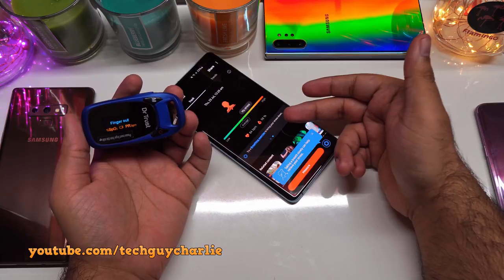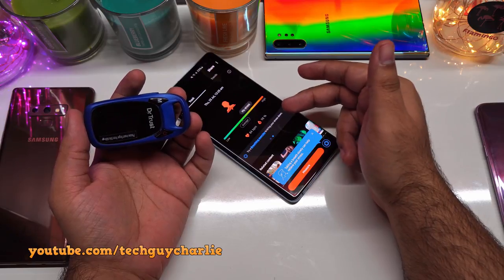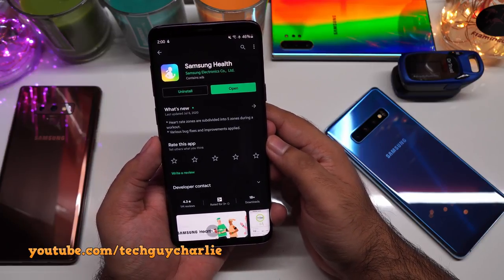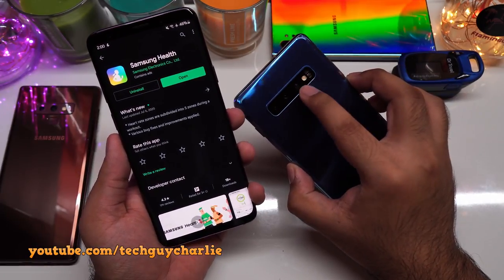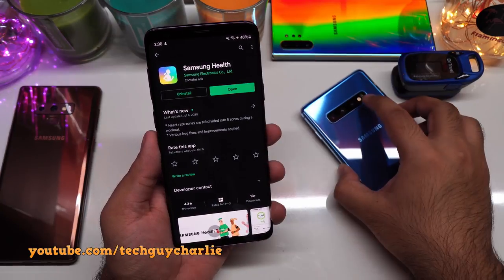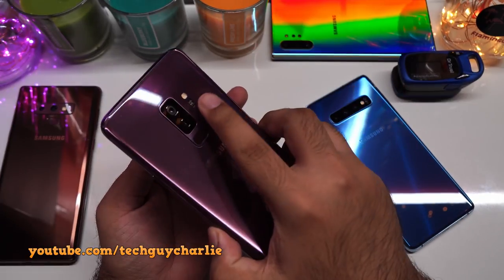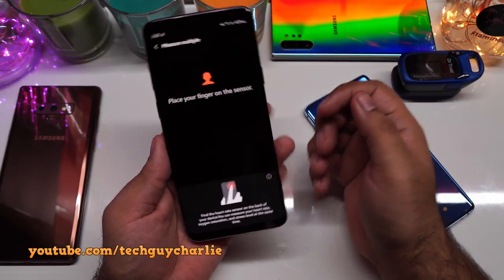The pulse oximeter on the Galaxy phone is quite accurate, but you should consult your doctor before substituting the phone for a proper pulse oximeter. There are many third-party apps on the Play Store that claim to measure blood oxygen saturation using the camera flash, but I think those will not be accurate. I urge you to use the official Samsung Health app, which uses the dedicated blood oxygen saturation sensor.